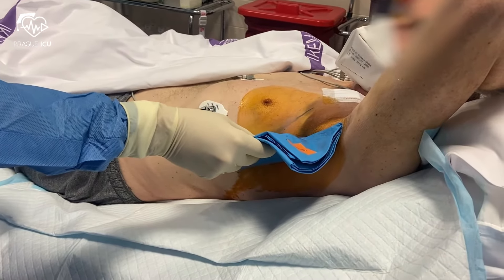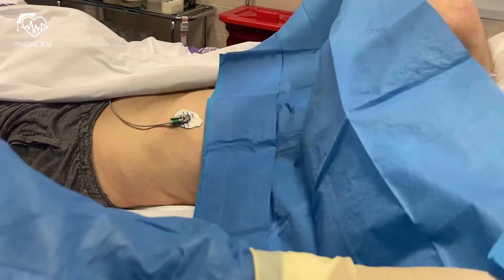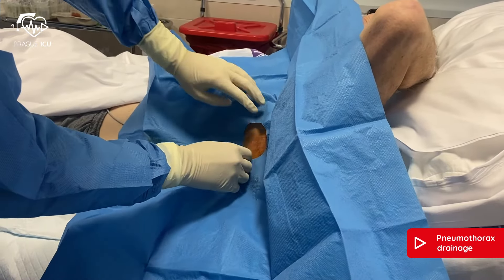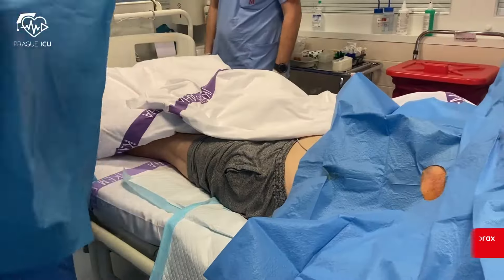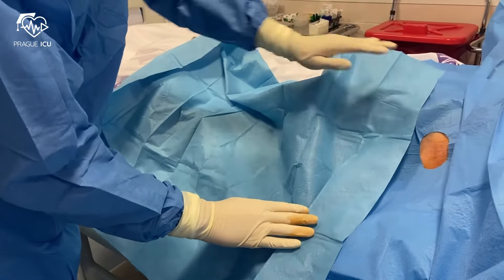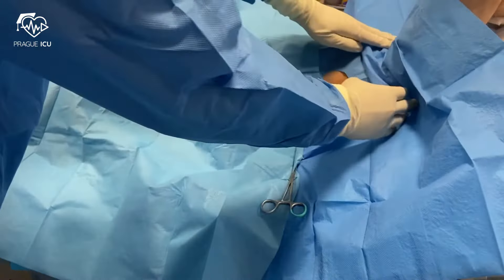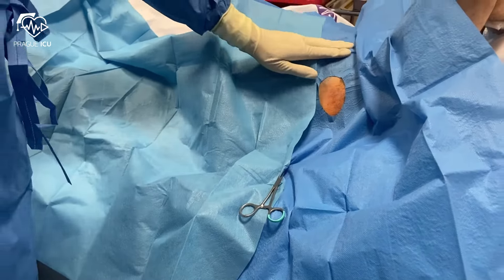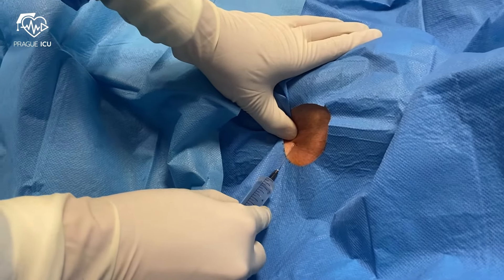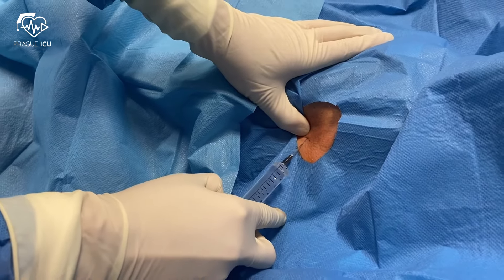Then drape the intended area. Anesthetize the skin, subcutaneous tissue, pleura and periosteum with the local anesthetic, such as lignocaine. We use 10ml of local anesthetic.